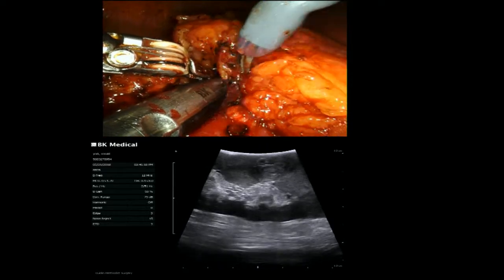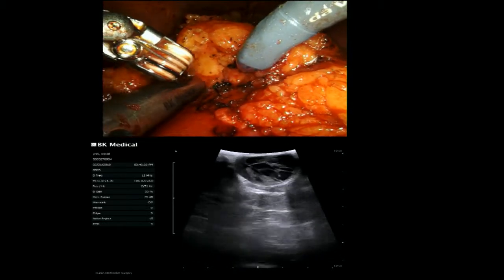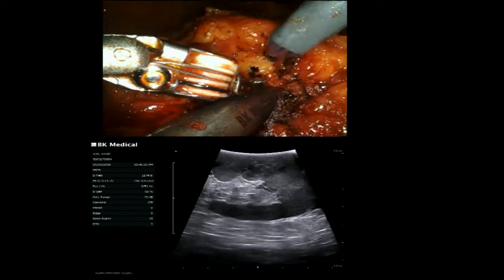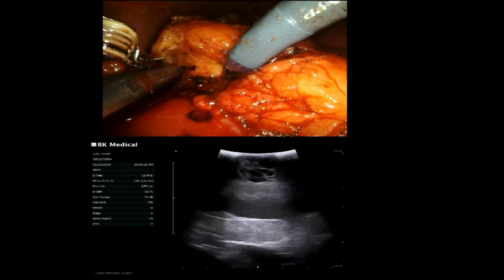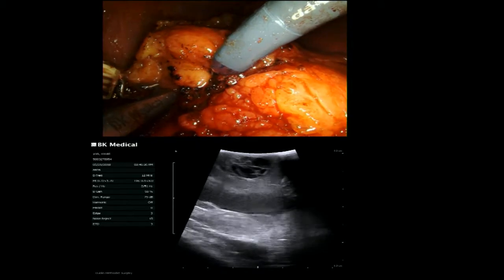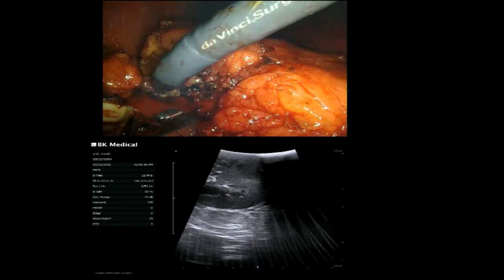Exactly. And that's what you want to try to connect in your mind when you're looking at your CT or your MRI pre-op and then what you're looking at intra-op doing your ultrasound. You want to try to connect those dots in your mind and make sure you're seeing things right, because you can easily get fooled, especially when you start rotating the kidney around and moving the kidney. You can easily get fooled. So I'm seeing the edge of tumor is way up here.